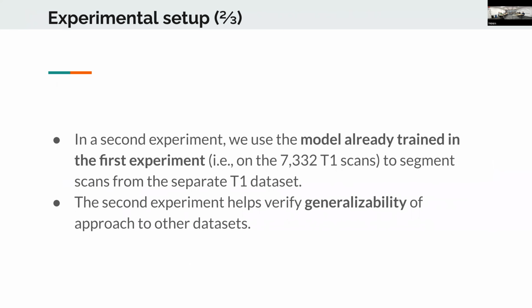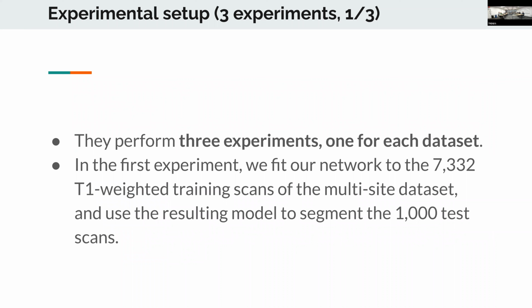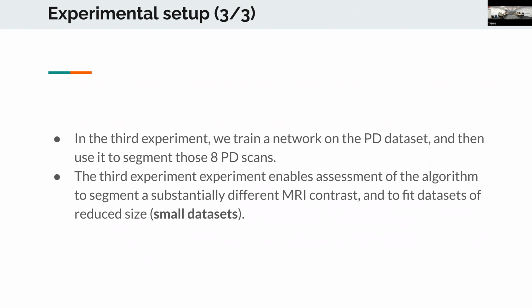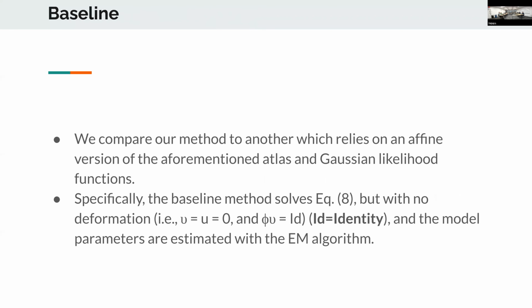There are several experiments. Some of them go into whether you can train this method on one data set and test well on another, and some determine how useful it is on small data sets. They compare the results against an expectation maximization algorithm, because that's another method considered unsupervised in a way. It's basically a clustering algorithm.